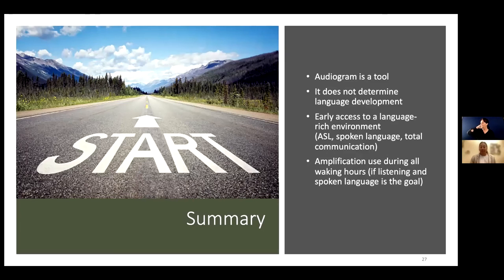Your other question about calibrating hearing aids. Hearing aids are calibrated using equipment in our office, and when we are calibrating it, we are looking to see how the hearing aid is functioning compared to the manufacturer specs. When we get a new hearing aid, the manufacturer will tell us this is exactly how much output, how much sound this hearing aid should be producing, and then we can run the hearing aid through our equipment and compare how this hearing aid is performing compared to what the manufacturer says a brand new hearing aid should be performing.